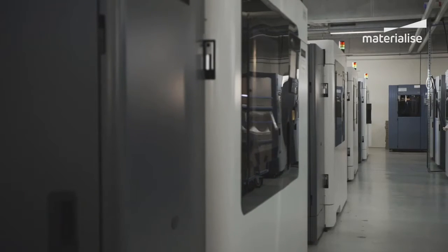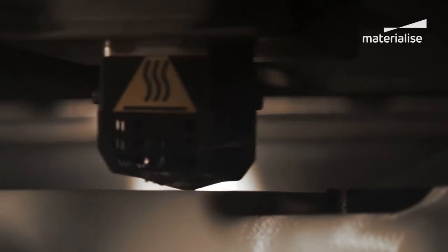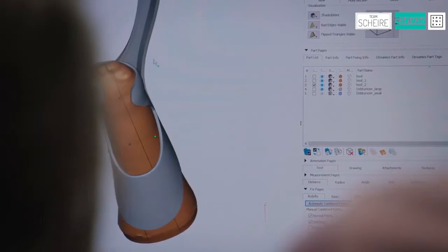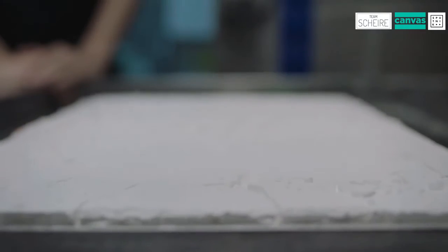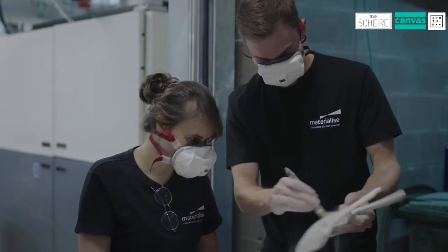3D printing, the amazing part of it is if you can imagine it, you can make it. But also because it's the technology that lends itself almost best to move from an idea to a product. Within this project we had a very short lead time, and we noticed that the 3D printing technologies here really have an advantage of being able to create fast prototypes as well as end pieces for the final product.